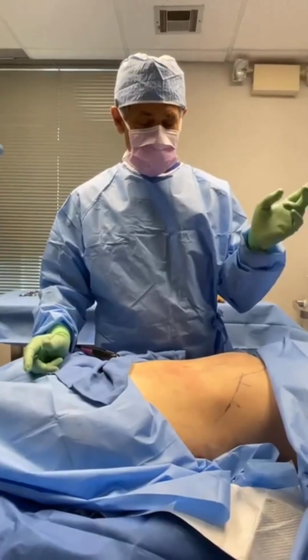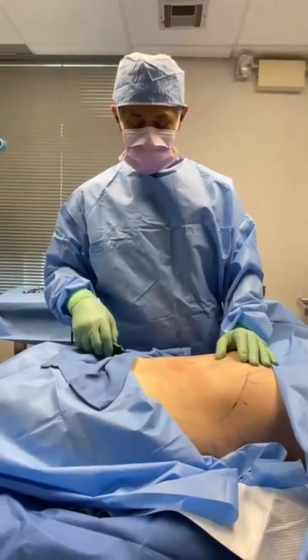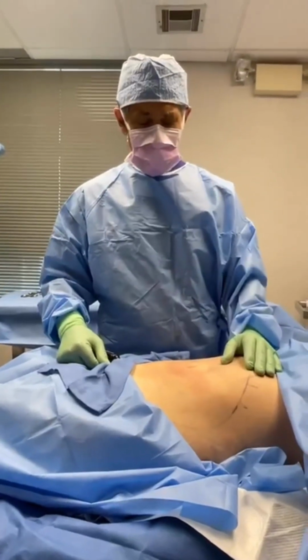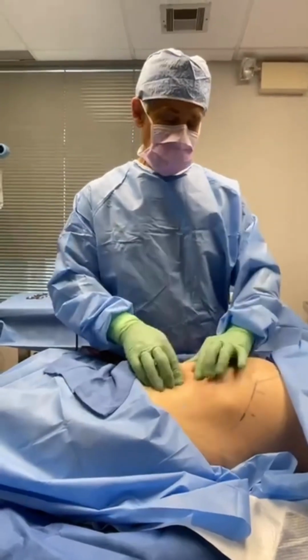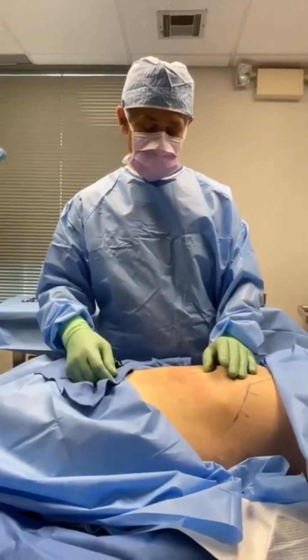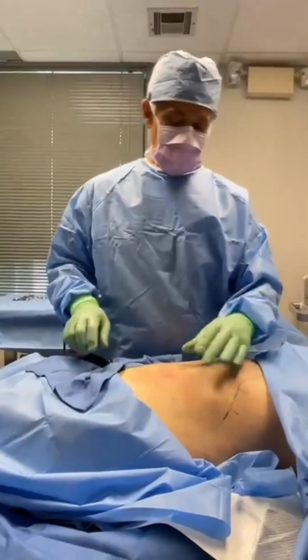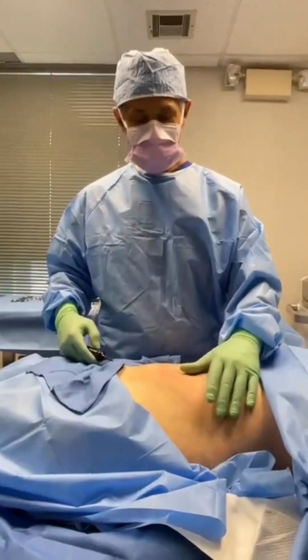She just asked me, is there a warm sensation with this Renuvion that I'm going to be using? I wouldn't say there's a warm sensation. The abdomen's fairly numb. In many cases, there isn't any sensation other than maybe me working around a little bit with my hands. Sometimes there's a little pinch. It feels like a little electric pinch. So we're just live, and we'll see how you feel, okay? So you'll tell the world how you feel. Hopefully you don't say anything wild. But anyway, here we go.